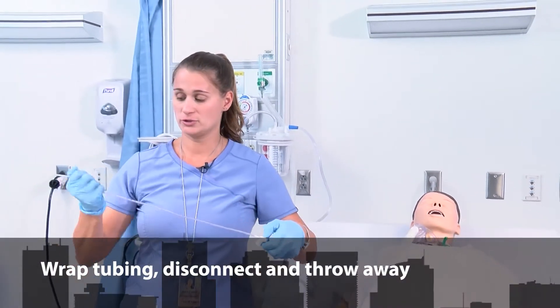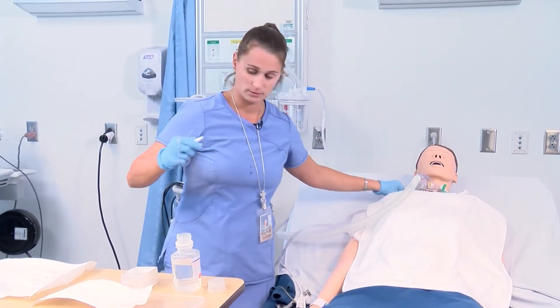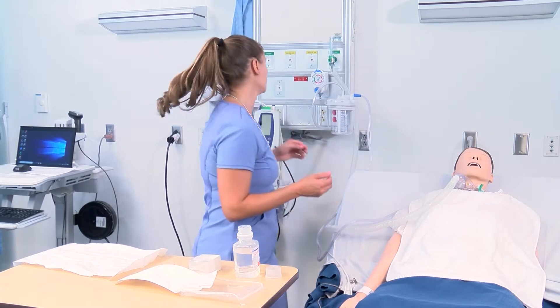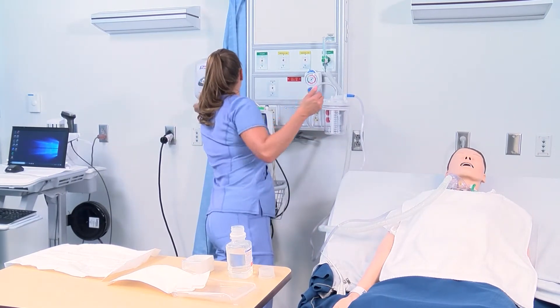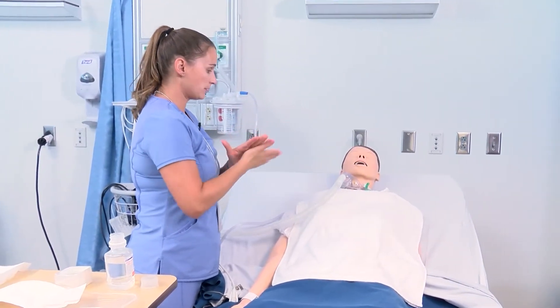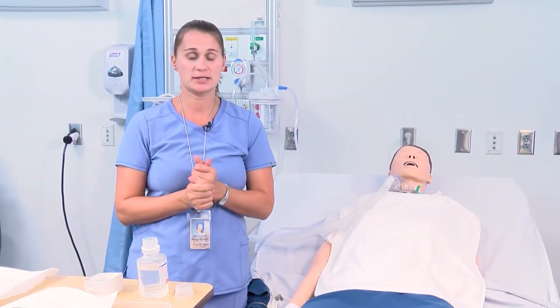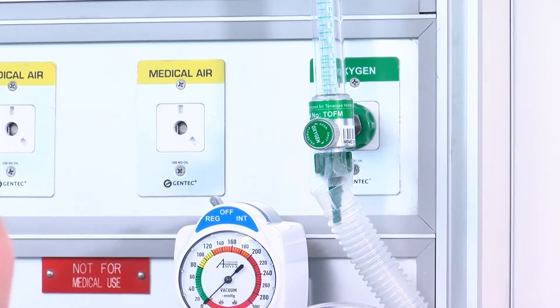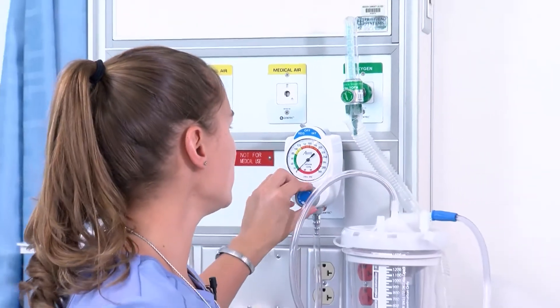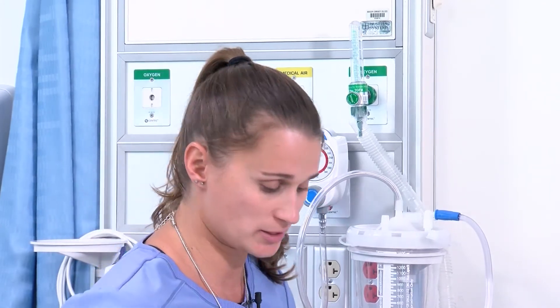Now I'm going to wrap my tubing, disconnect, and place it in the trash. I clean my hands and observe the patient's respiratory status and oxygenation level, then reassess his lungs. I'm going to turn the oxygen back down to baseline and turn the suction off since we're no longer using it.